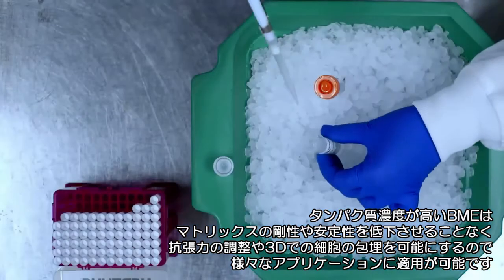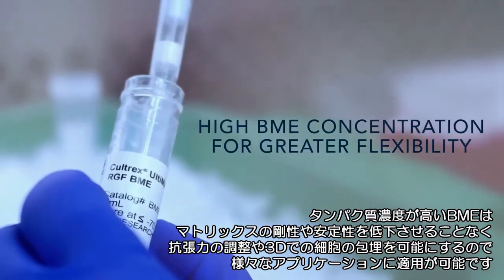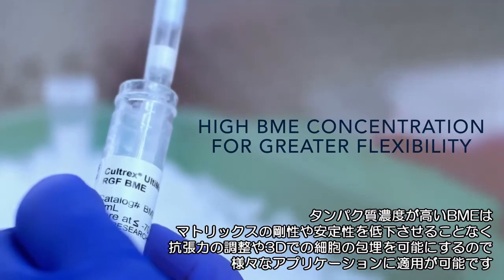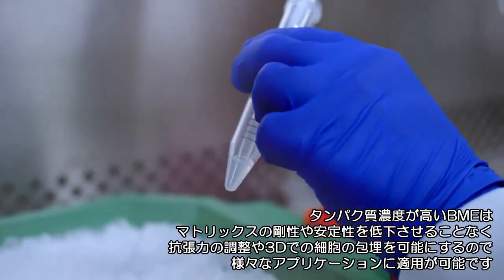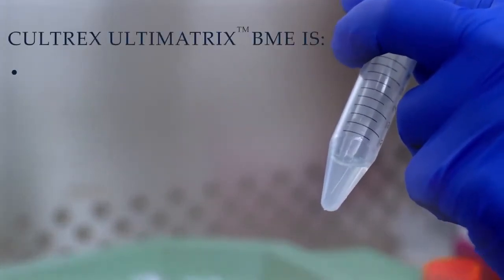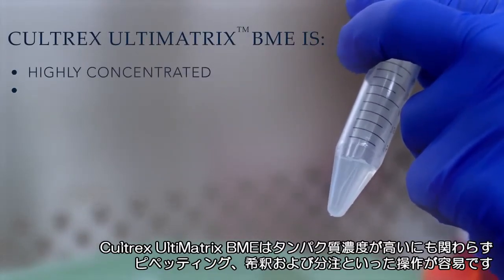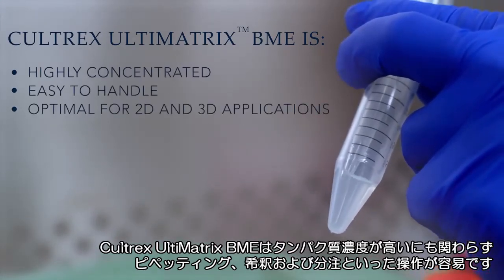BME with a high protein concentration provides researchers with greater application flexibility, enabling adjustments to tensile strength and embedding of cells in 3D without sacrificing matrix stiffness or stability. Increased protein concentration typically impacts solution handling, but at high concentrations, Caltrex Ultimatrix BME remains easy to pipette, dilute, and distribute.